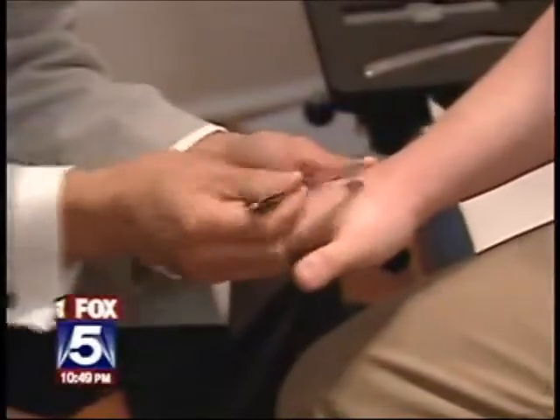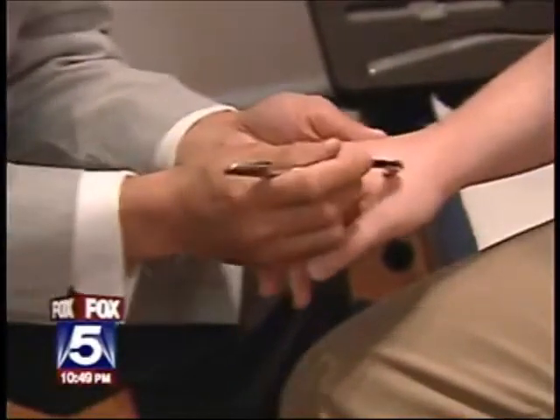Once he feels that grittiness, Dr. Ng hones in. He says the Graston technique is not a fix-all, but it seems to work well for overuse or repetitive strain injuries. So why turn to these odd-looking tools like the handlebars or the scanner? Maybe because nothing else is working.